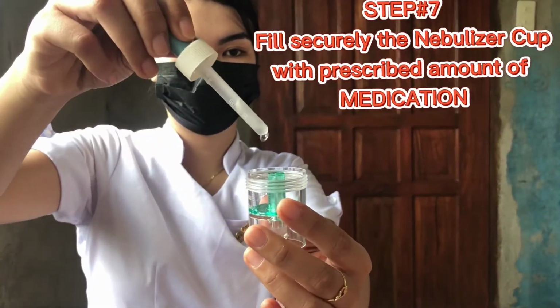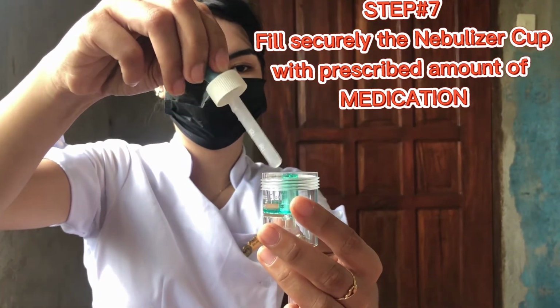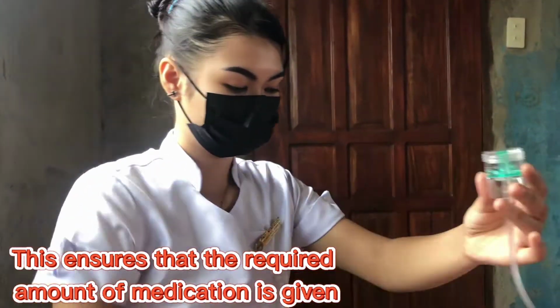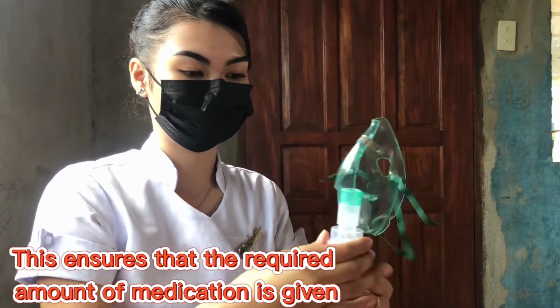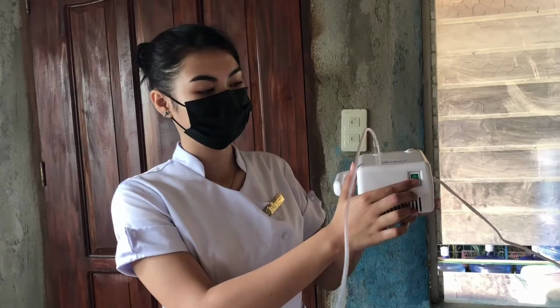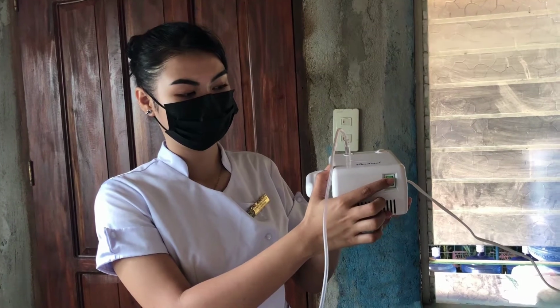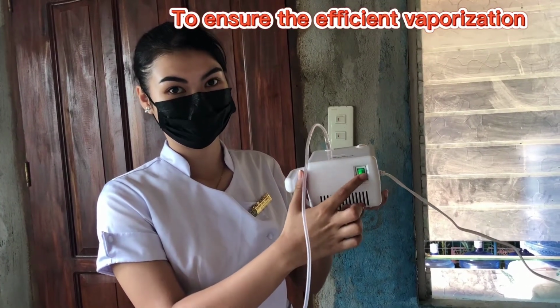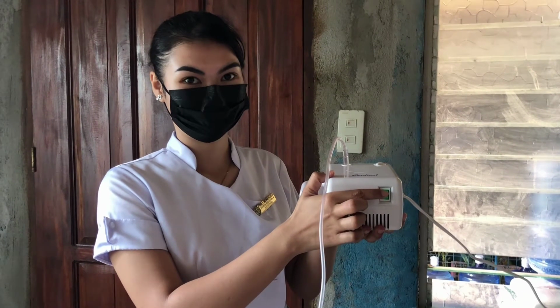Step number 7. Fill the nebulizer cup with the ordered amount of medication. This ensures that the required medication amount is given. Step number 8. Turn on the power button of the air compressor. This is to ensure efficient vaporization. Step number 9. Observe the fine spray from the nebulizer to check that the equipment is working.